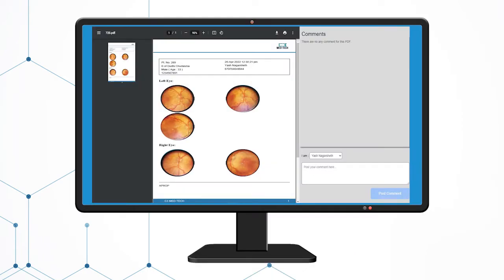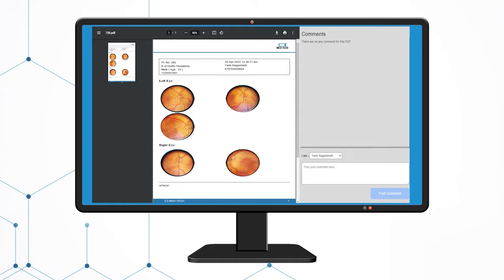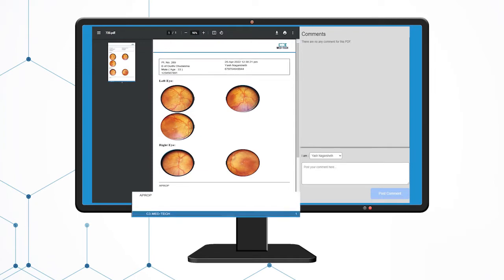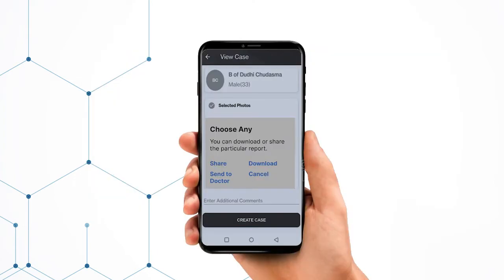This will generate a PDF containing the patient info, examiner info, the selected images, and additional comments at the bottom. This report can be printed out, shared with the patient, and also kept for record keeping.